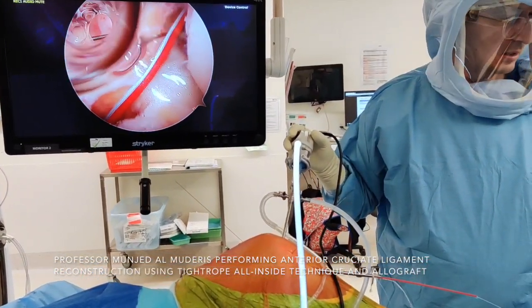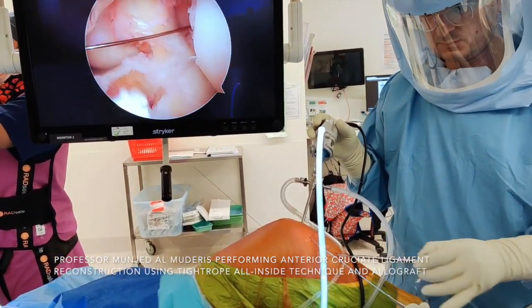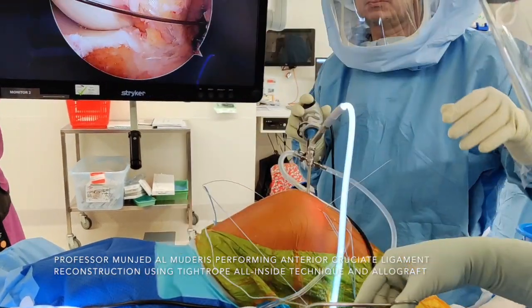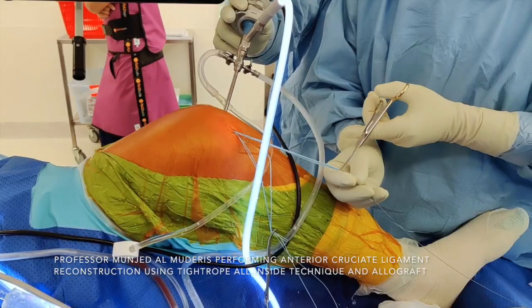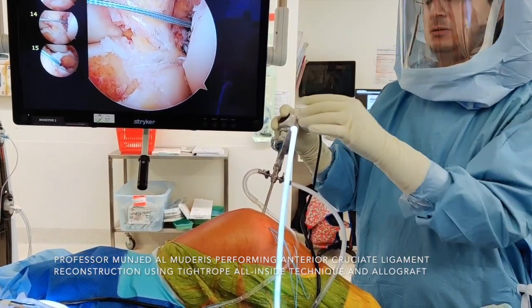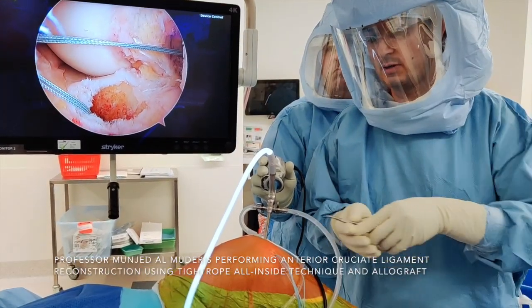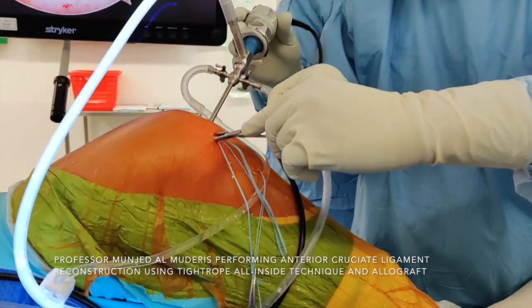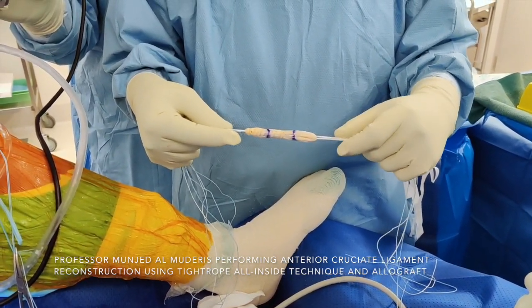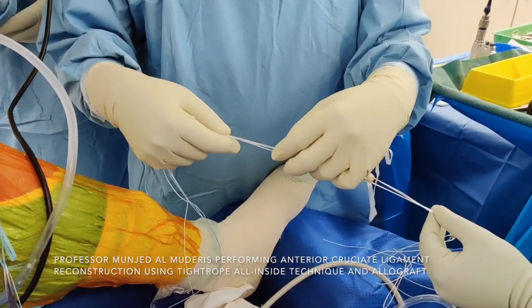I unclip the flip cutter and use a passing suture — this is called a Nitinol wire — but you can use any kind of suture material to retrieve the graft from the tibial tunnel. I then use another suture to retrieve the femoral side of the graft. You pull the wire through and cut the loop, so you have one suture coming from the femur and one suture coming from the tibia. This will retrieve the graft through the anteromedial portal. Before inserting the graft, make sure the anteromedial portal is large enough to accommodate the graft.